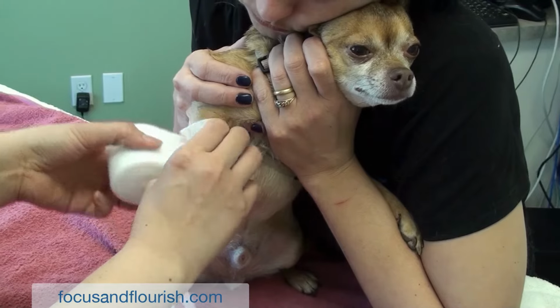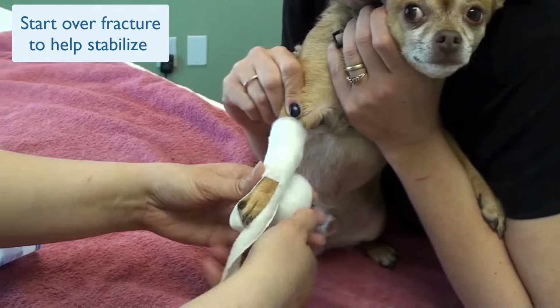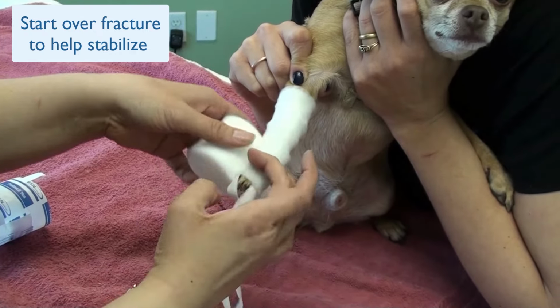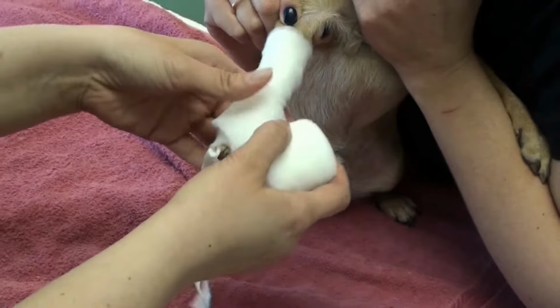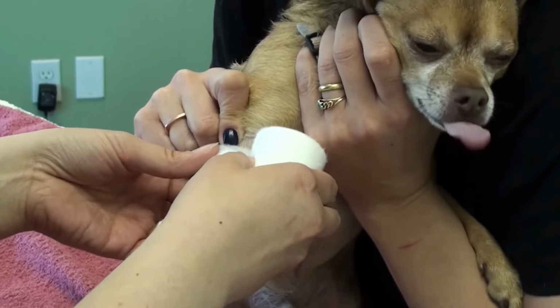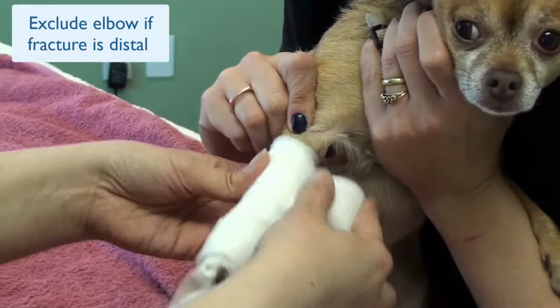Normally when we start a bandage, we'll start at the toes and work up, but because we're pretending that there's a fracture in the distal radius, she is starting the bandage at the level of the fracture. The faster you get that fracture under bandage, the more comfortable the patient will be. She then takes it down to the toes, and we're going to go back up to the elbow, but we're going to exclude the elbow.